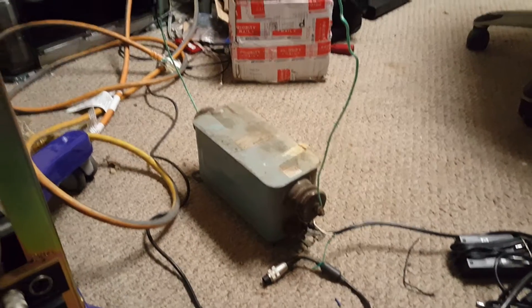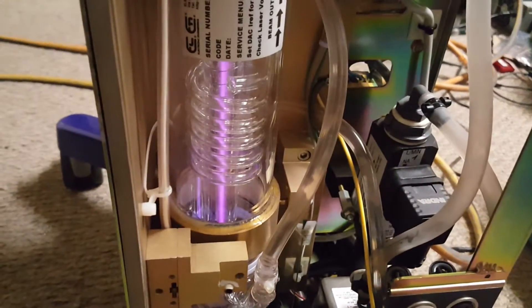Alright, here's the neon sign transformer hooked up to the laser tube. This was one of the suggestions as a follow-up to my last video.